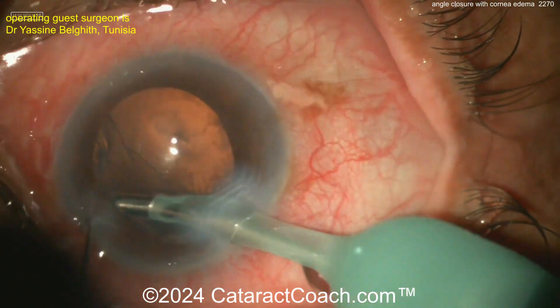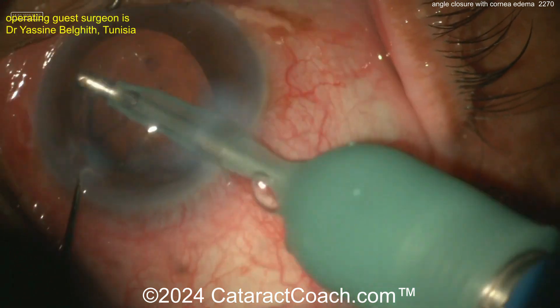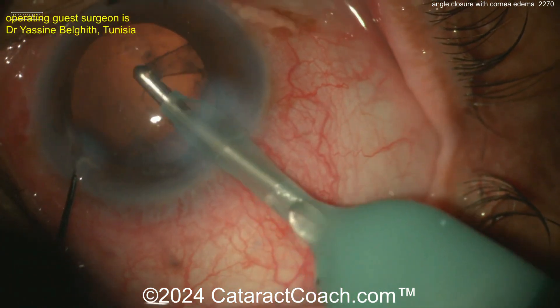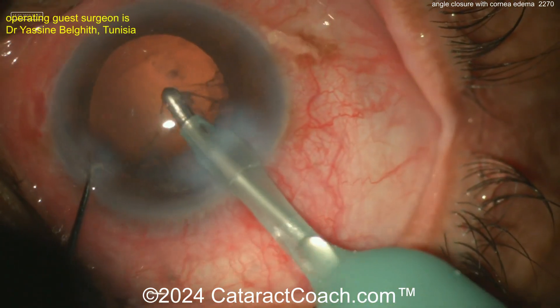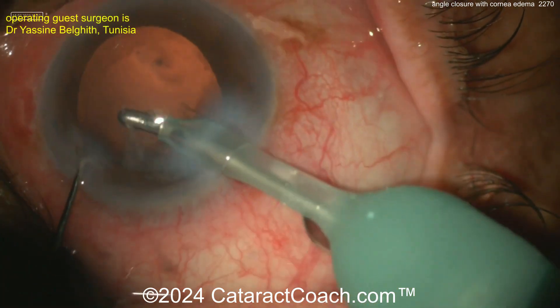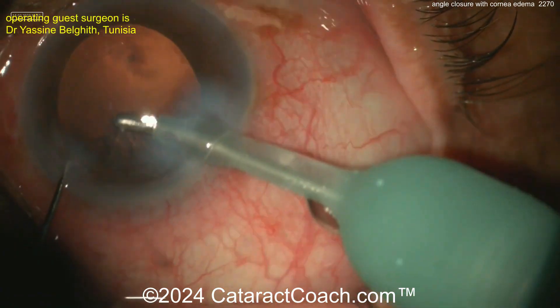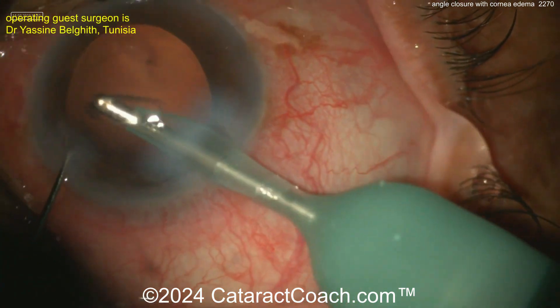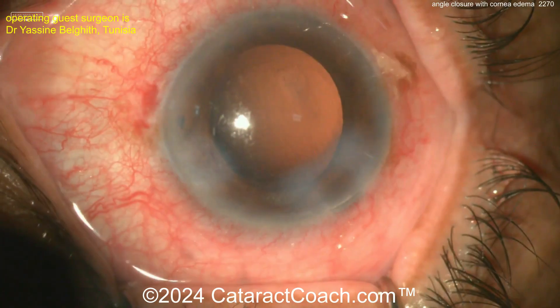Cortex removal here with the I/A probe — pretty routine, cleaning this up nicely. Look at the cornea, look at the Purkinje light reflex. Those amazing endothelial cells, once you quit torturing them with ultra-high pressure, start to perform pretty quickly. It's pretty normal to see the cornea clear up while you do the case. All of a sudden the cornea looks pretty clear.